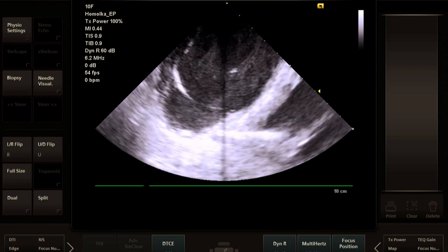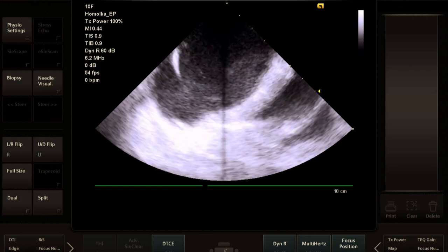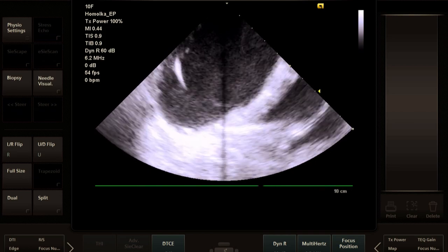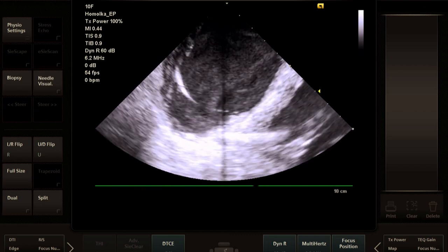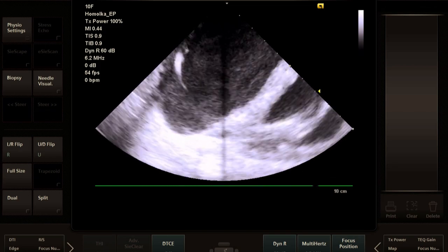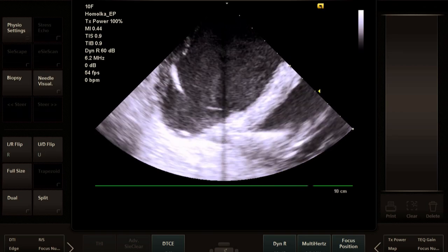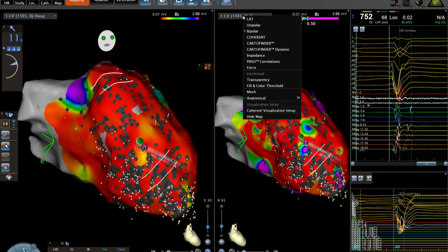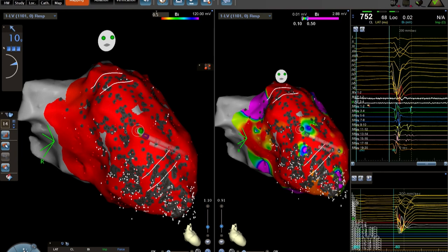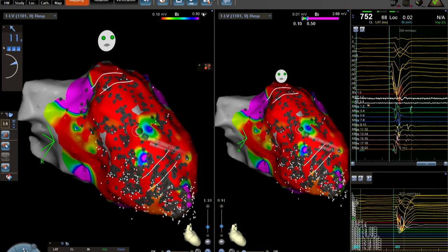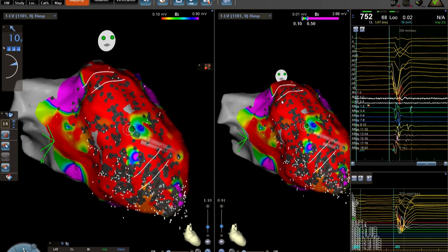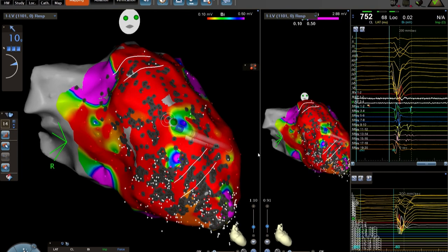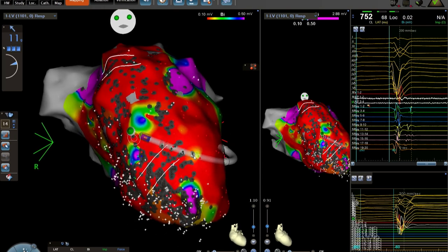Strategy for this patient: he's 80 years old, frail, with tandem heart. I'm a strong believer that procedures in this case should be strategic and short. We identified with ICE where the area of scar is and went directly with the multi-electrode mapping catheter via transseptal approach. The voltage map shows a large area of voltage abnormality consistent with echo: the apex is completely scarred and thin, akinetic, even something that looks like an aneurysm, going all the way to the base.